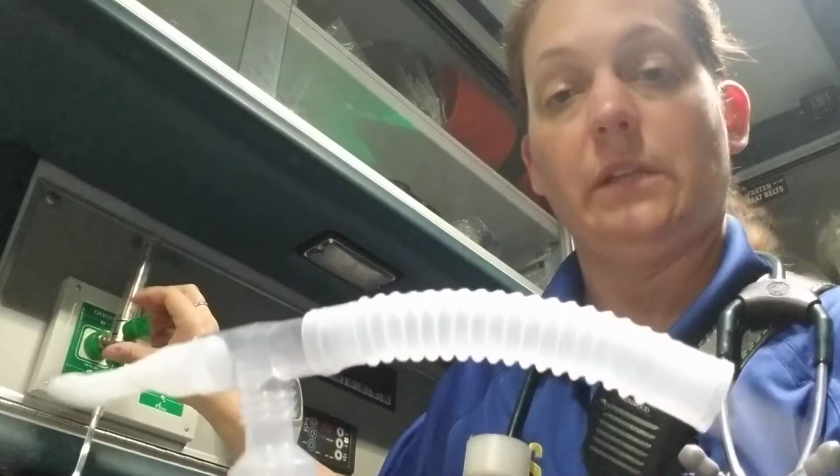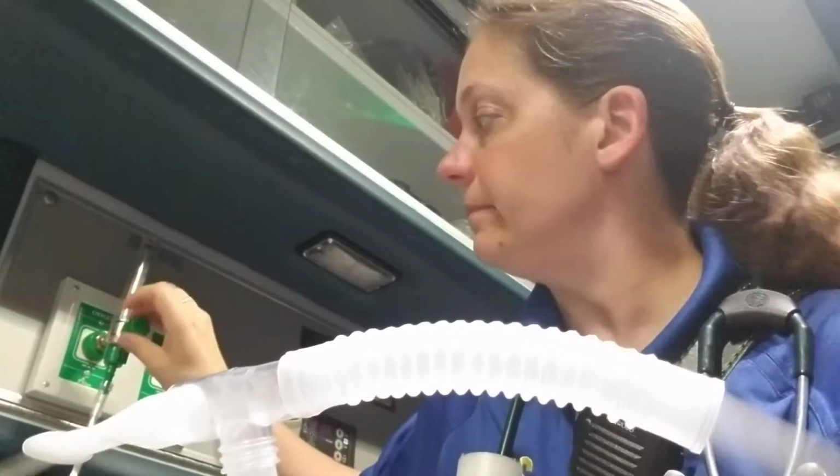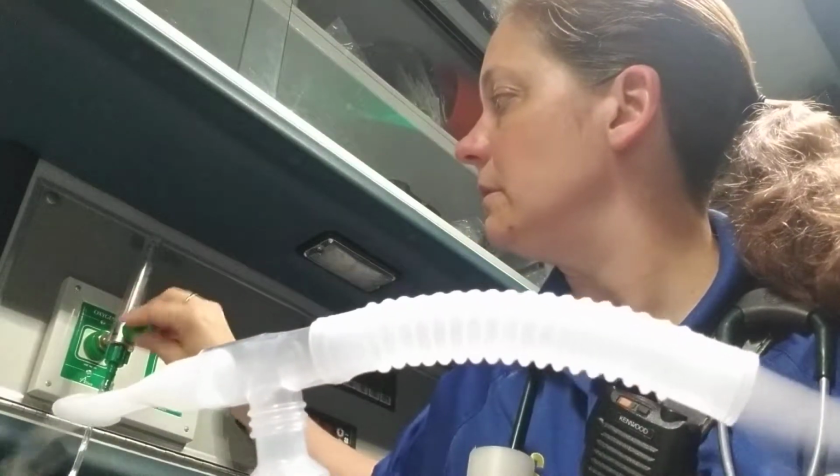Okay, so we'll assume 10 minutes has gone by, give or take a little bit. Turn that off. I ask him if he has any questions about the medication or how to use his small volume nebulizer before we move on to the next one.